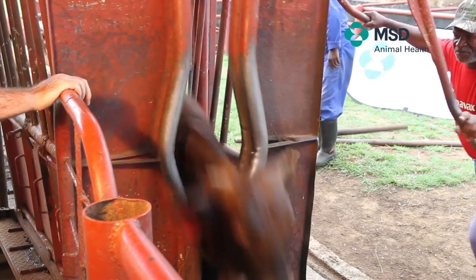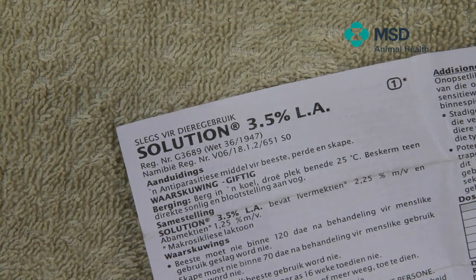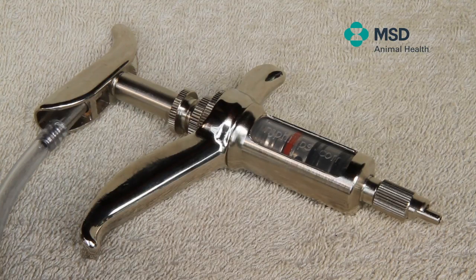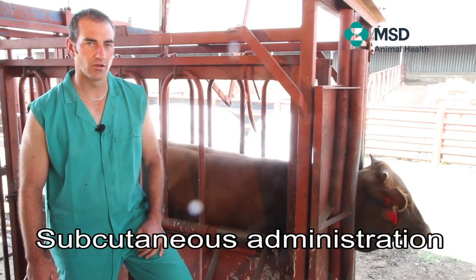Also make sure that before you use any product, you read the package insert with regards to dosage, administration and any other special precautions. It's advised to make sure that all equipment, product and facilities are ready to go before you start handling the animals. This reduces time spent in the crush by the animals as well as stress on the animals and the animal handlers. In this video we will be discussing the subcutaneous injection of an animal.